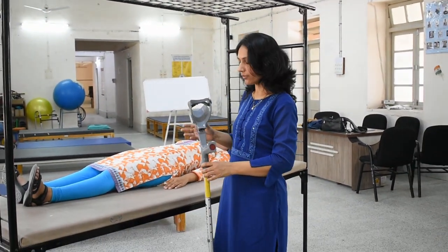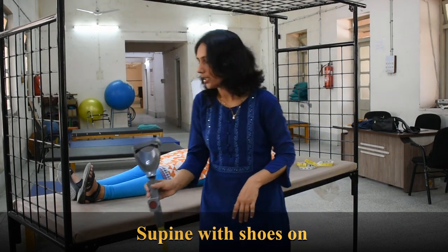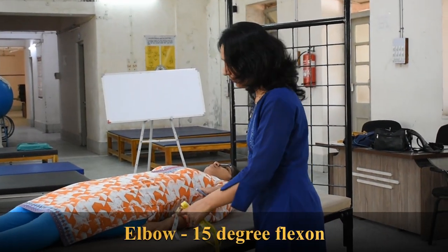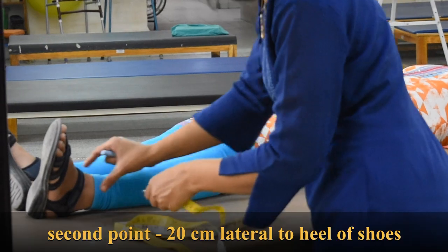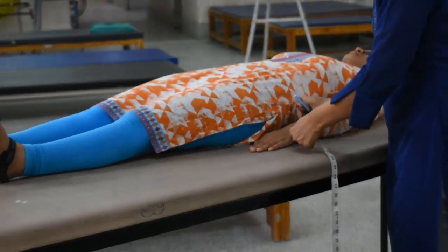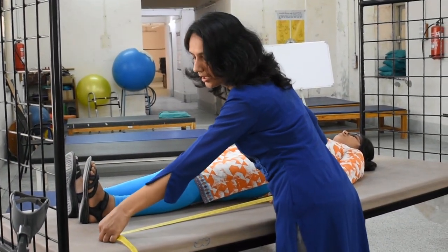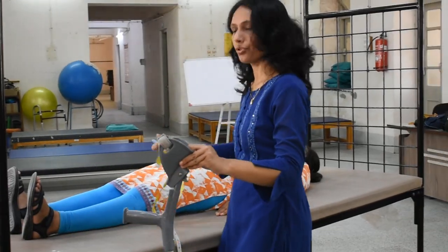For the measurement of the elbow crutch or forearm crutch with patient in supine position with shoes on: we position the elbow in 15 degrees of flexion. The first point is the radial styloid process, and the second point is 20 cm lateral to the heel of the shoes. Taking the measurement from the radial styloid process to the point 20 cm lateral to the heel of the shoes — here it is coming to 35 inches. This is the measurement of the elbow crutch in supine position with shoes on.